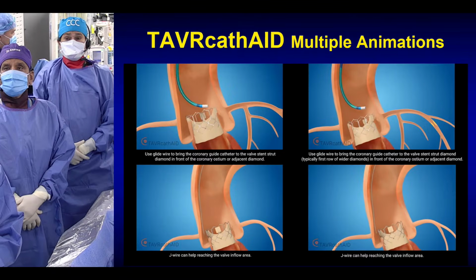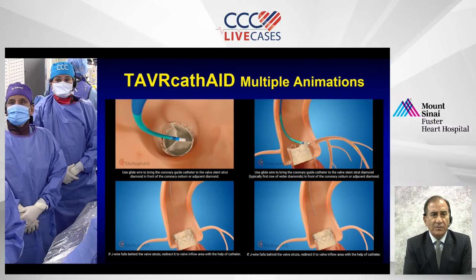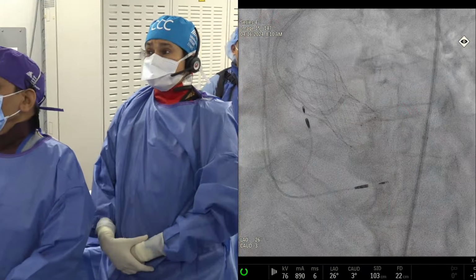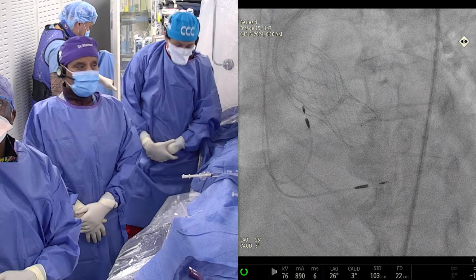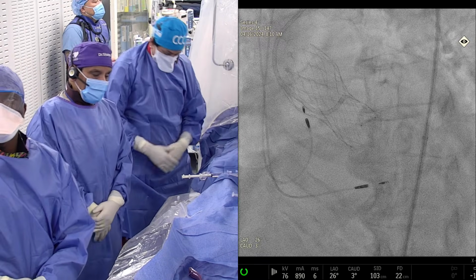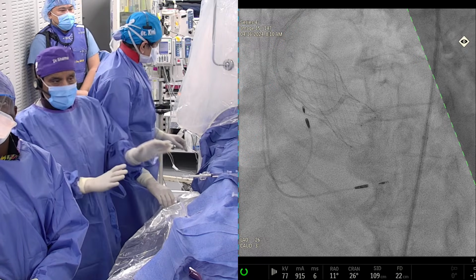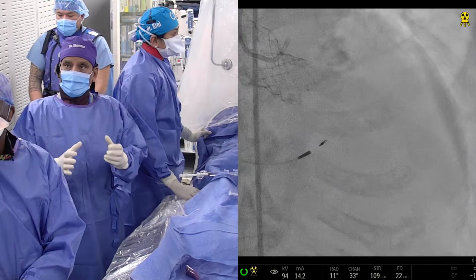Samin, have you found any particular brand of the guiding catheter which probably has the softest tip or helps you better, with the Evolut valve? Very good point. So what we do, actually, the majority of the guide catheters we use are the Mach 1, which is the Boston Scientific soft one. There's a stiffer one, which is the Runway. And then we have the EBU catheters of Medtronic. Usually we don't use those stiffer guides, but they may be preferred in these cases because they give the support.